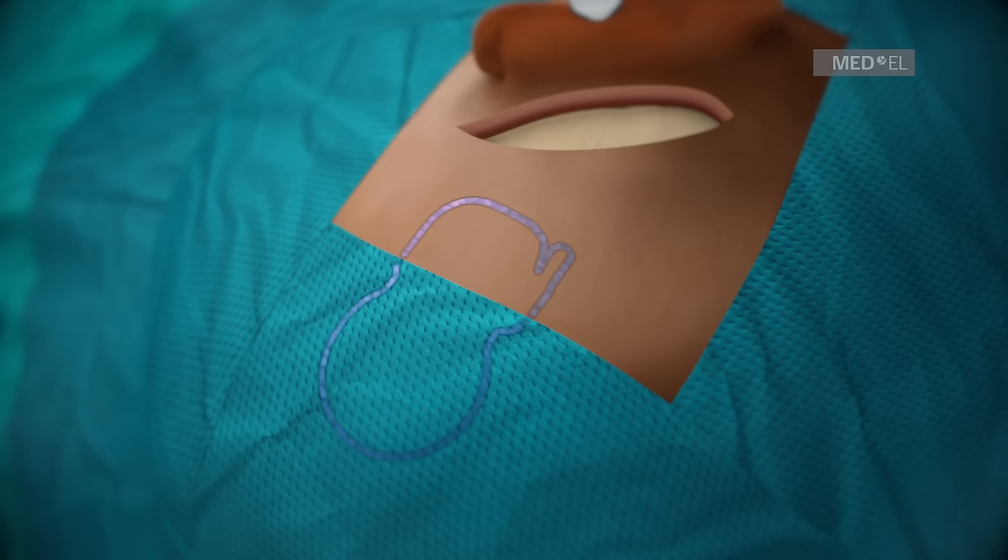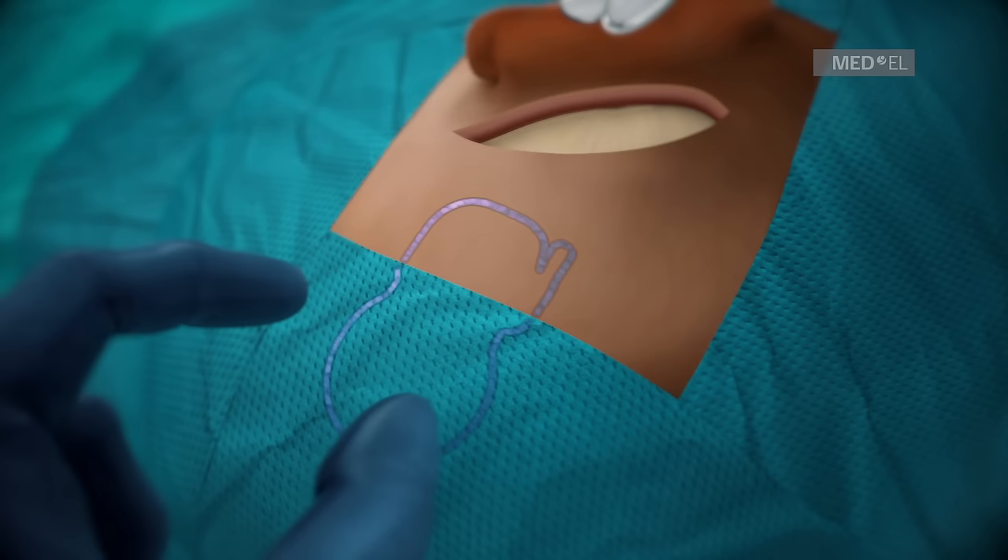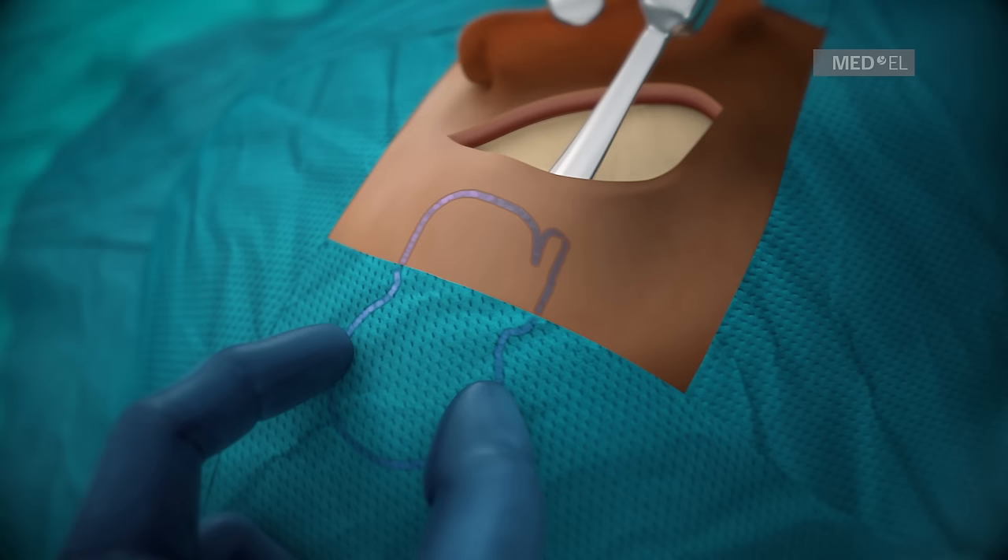Step 2: Preparation for Implant Fixation. A tight subperiosteal pocket can be achieved by using the fingertips to feel the tip of the retractor at the rim.